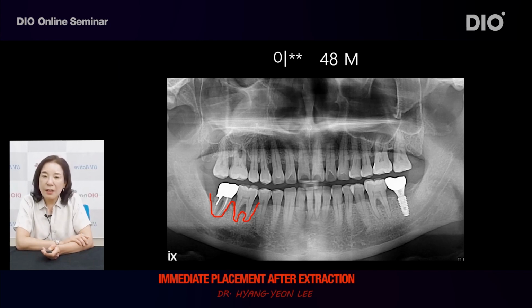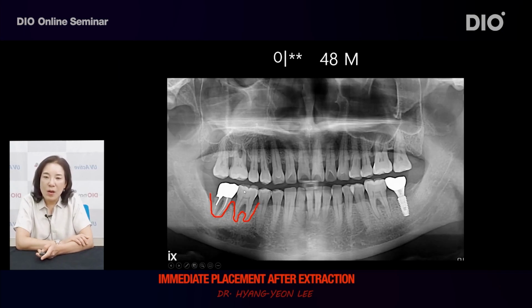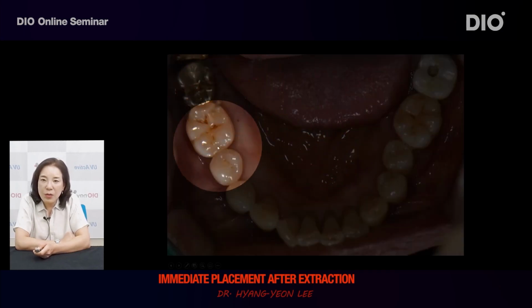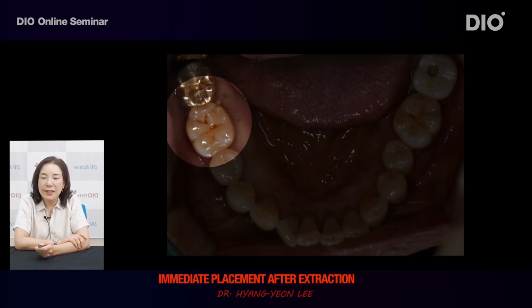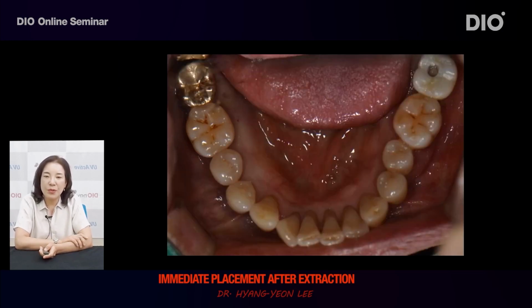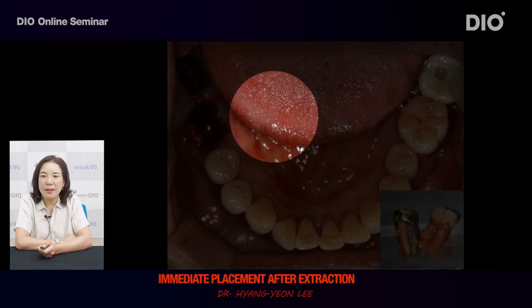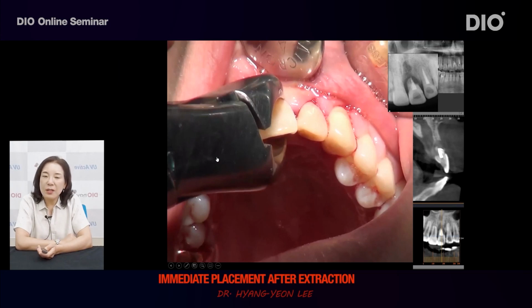For this patient, number 6 and number 7 mandibular teeth on the right with severe inflammation will be extracted and implant will be placed. Although the bone absorption is extremely severe under the X-ray, it can be seen that the gum is intact and raised to cervical when examined clinically. Since GBR will be performed by using this gum, which is raised to the cervical, this gum must not be removed. Tooth is extracted and flabby gum is remaining. Inflammation was removed thoroughly.